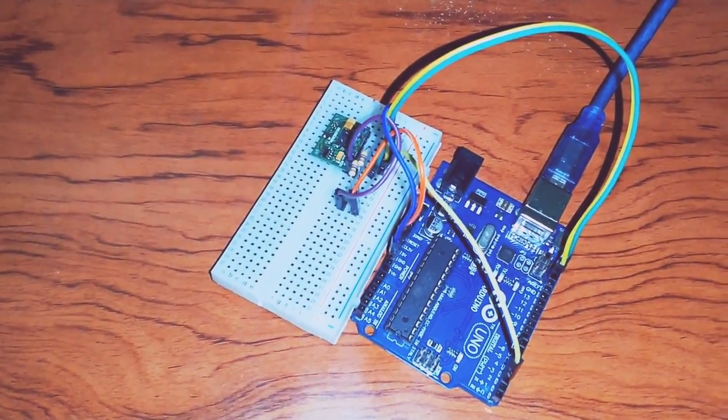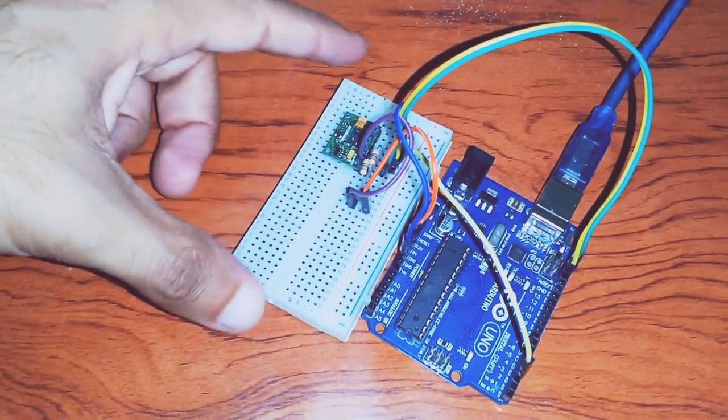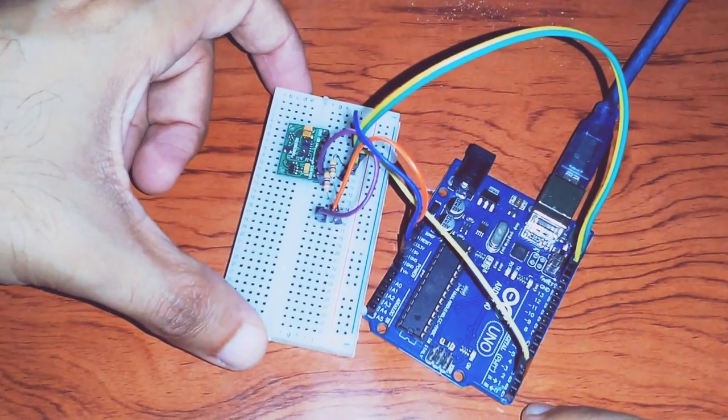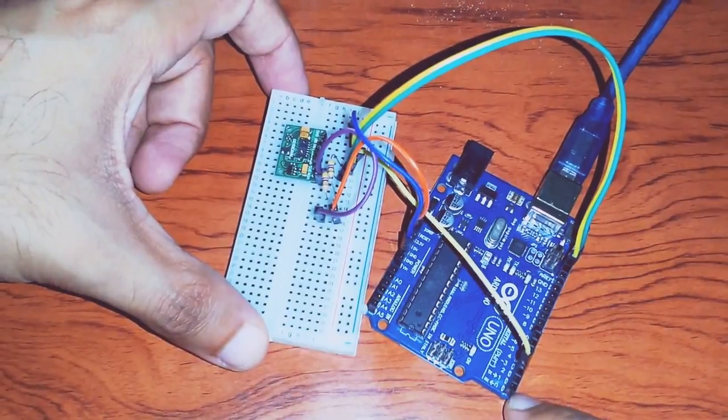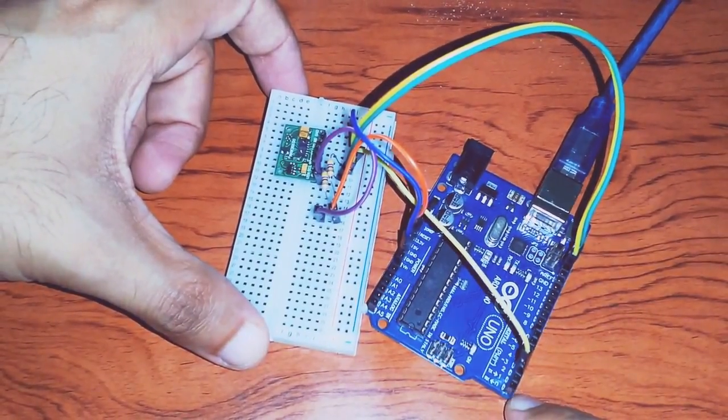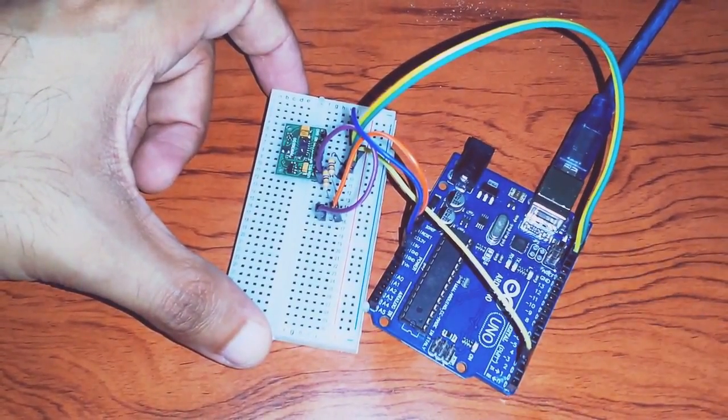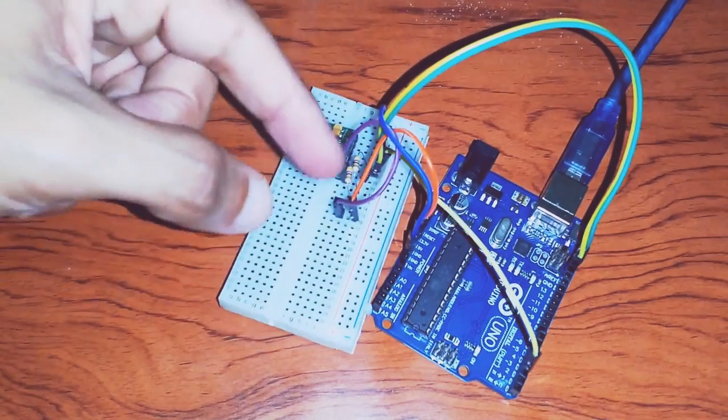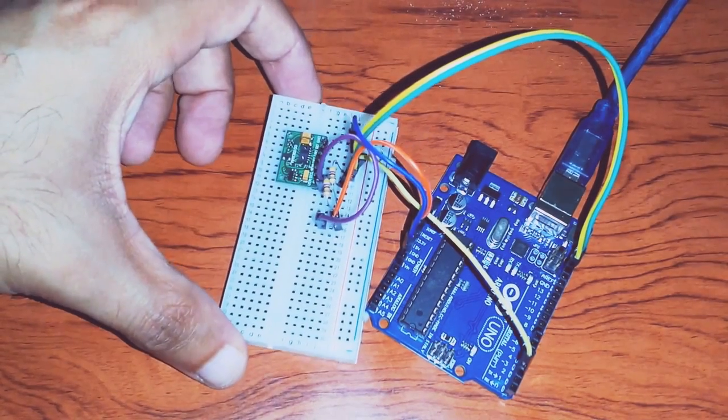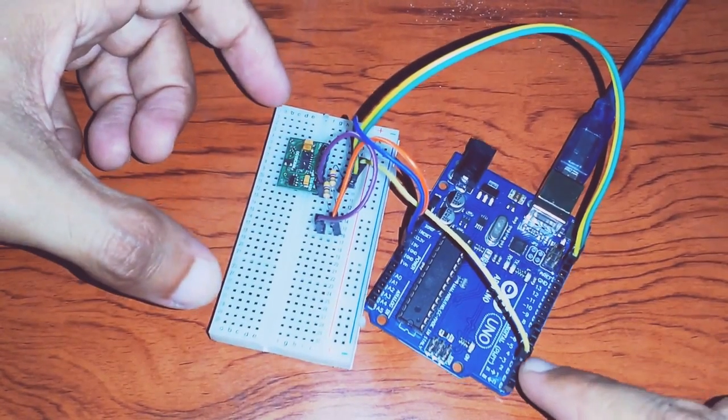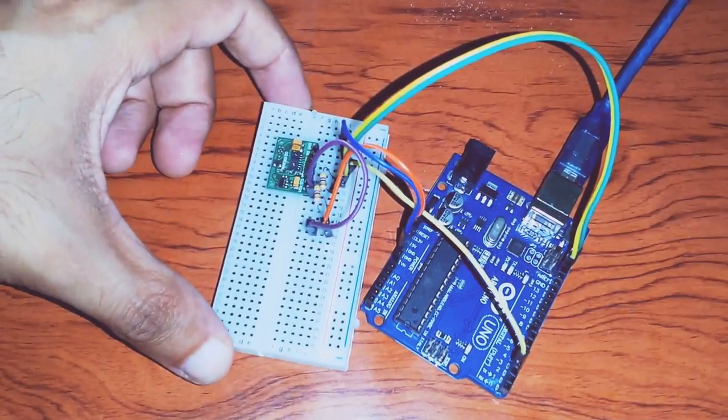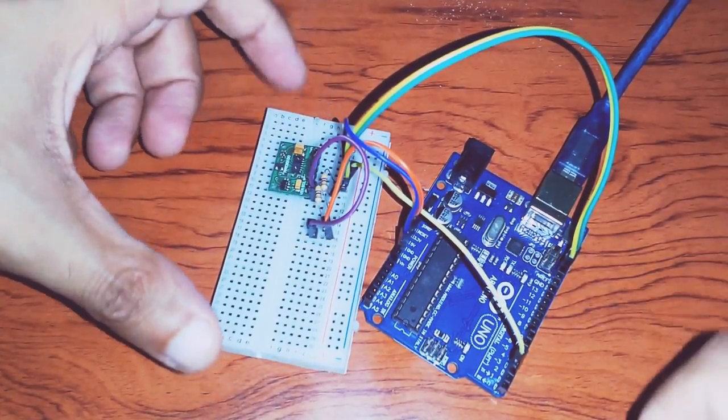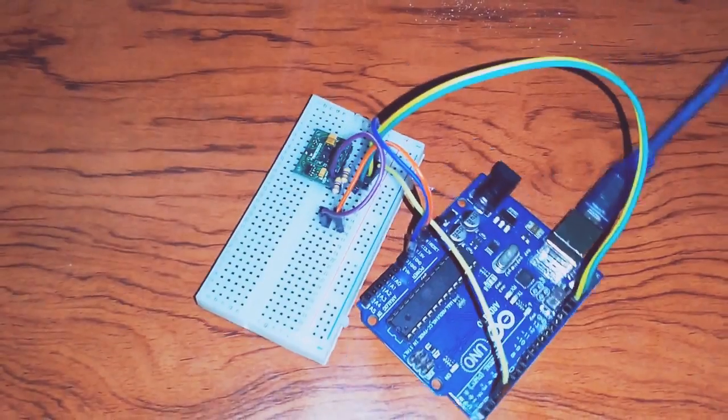I started by connecting the VCC of the sensor with the VCC of the Arduino. The SCL and SDA pins with the SCL and SDA pins of the Arduino, but with pull-up resistors to VCC. The interrupt pin was connected to pin number 2 on the Arduino, and the ground with the ground. So let's operate this thing.